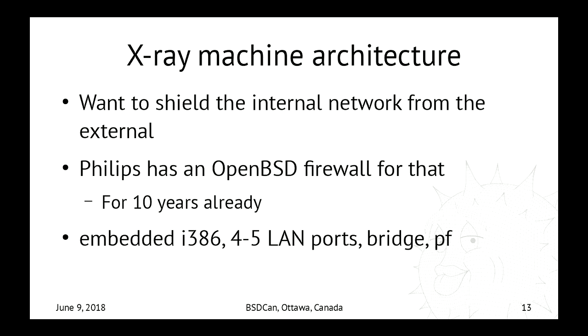So you obviously want to shield the internal from the external network. And as opposed to many other vendors, Philips actually cares and is doing that. Others, not so much. Philips has had an OpenBSD firewall for that for 10 years already, and I had no idea. I don't think anybody knew this. It was one person, Holger, actually, who's on the thank you page in the end, who did this as his master's thesis, developed that little OpenBSD box, shielding the internal from the external network.